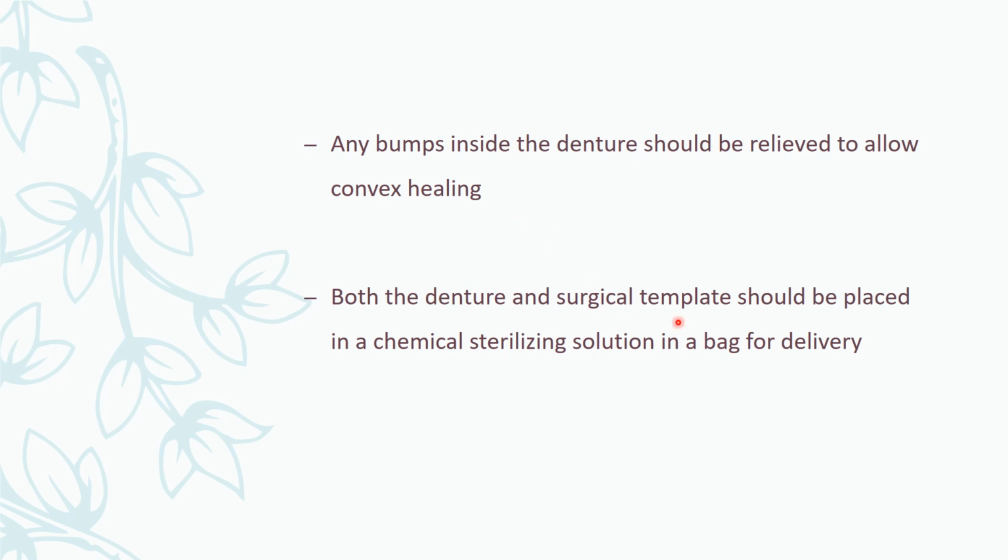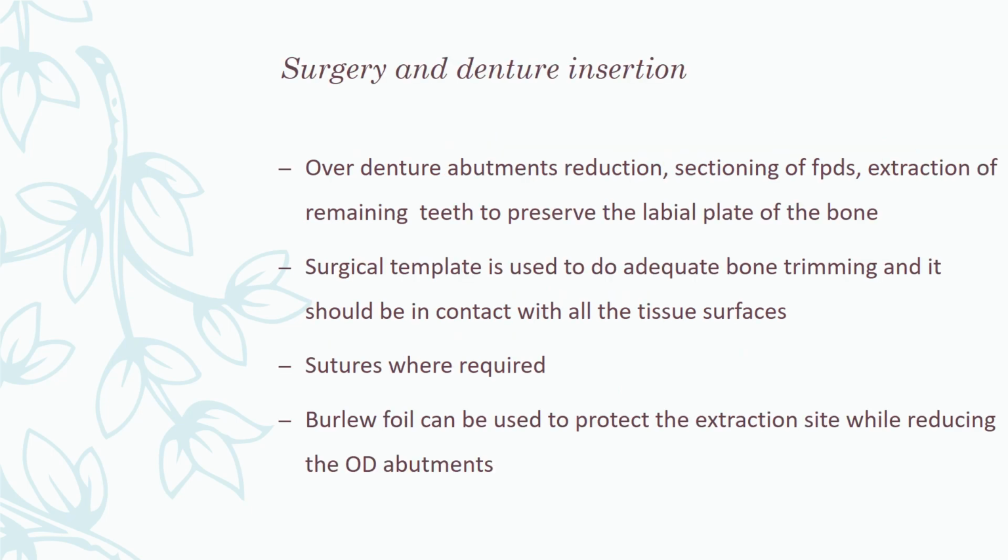Both denture and surgical templates should be placed in a chemical sterilization solution in a bag for delivery. So anything should be sterilized before using, because we are basically dealing with some amount of blood in the mouth, if not too much, a little bit here and there.